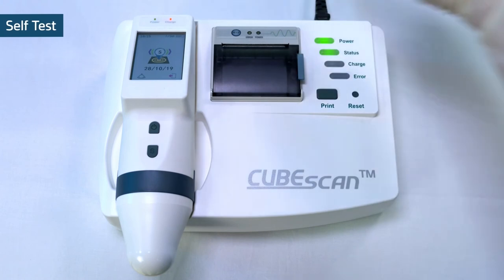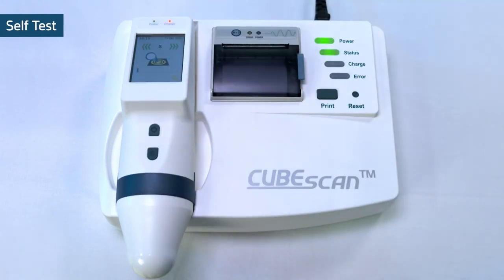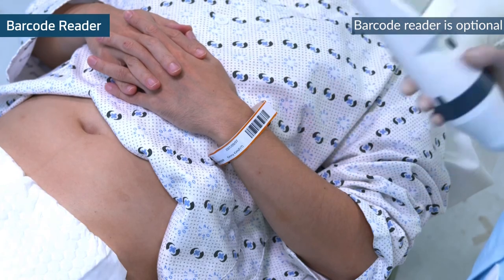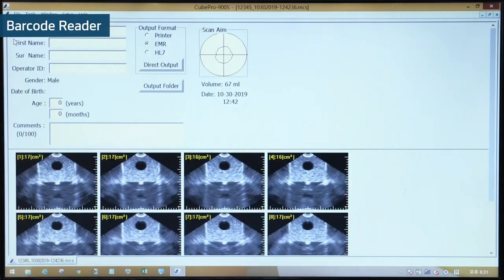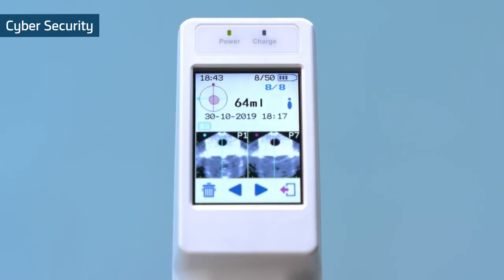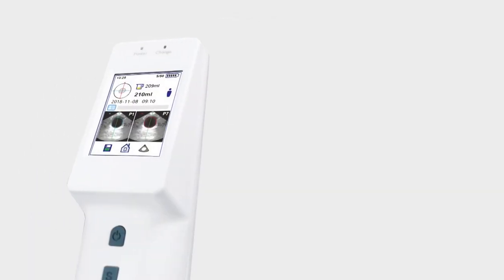Self-test: the self-test function enables an overall condition check of the device to save your maintenance time and cost. Barcode reader: save patient information with a barcode reader in a split second. The saved information can be transferred to the EMR system. Cybersecurity: the saved patient data can be secured by locking of data review. Scan anytime, anywhere, beyond the limitation.